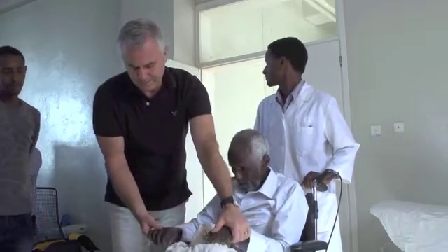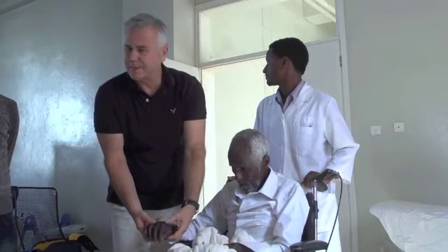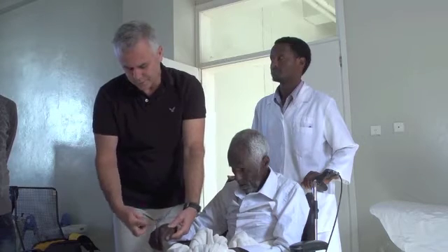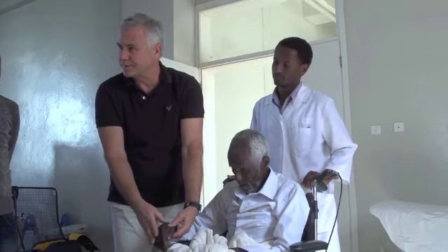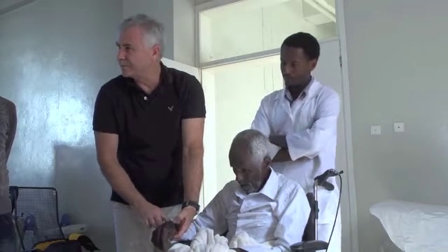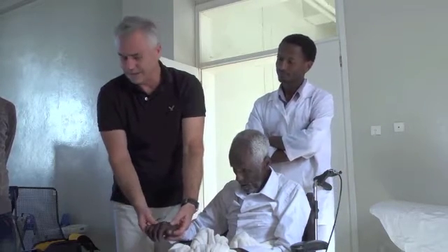The hand — there's no real temperature difference, but we have edema. So we want to improve the blood circulation drainage towards the hand, which means we are going to apply the tape on the dorsal part of the hand, as we did yesterday.